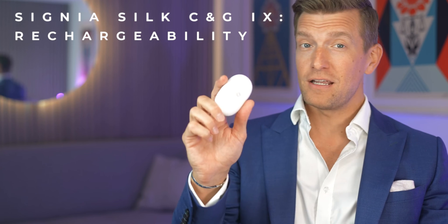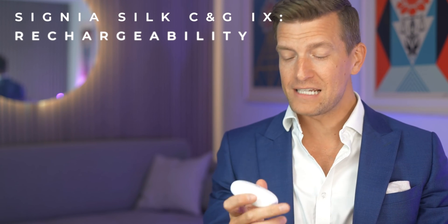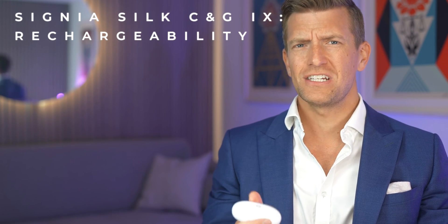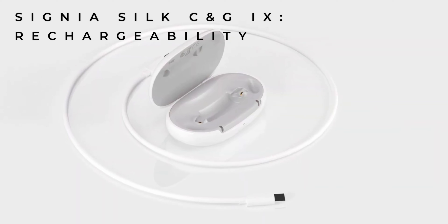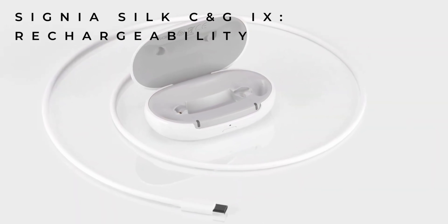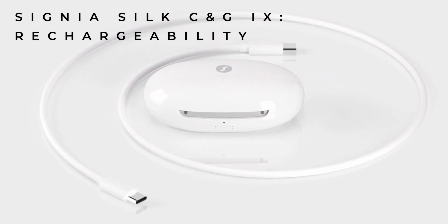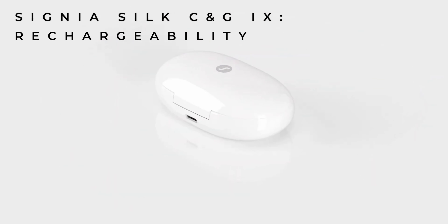As these hearing aids are the gift that keeps on giving, in another world first, the case itself has Qi charging — which essentially means that you don't need to plug it in to charge it, but instead can place it on a wireless charging pad for inductive charging. Or, if you're old school, you can still use the USB-C port on the back of the case.